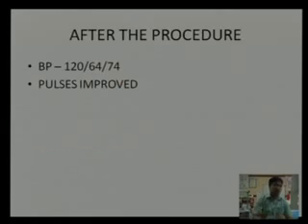It's not very significantly improved, but marginally it improved, and the pressure is very good. So the issue we thought of after that is the renal artery, which we can do in a graded approach. Over a later time we can put either an open cell self-expanding stent, because the renal artery origin is also involved in that. So this time we did only the coarctation upper segment, and that gives a good result. So in the graded approach later we can tackle the renal artery as well as the abdominal aorta also.